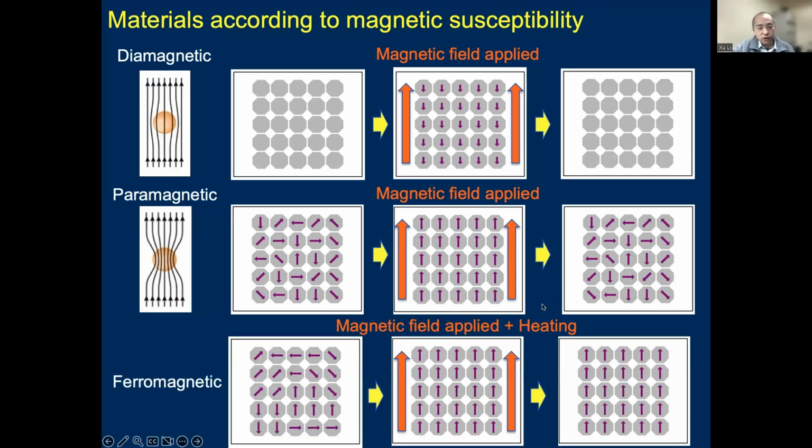And ferromagnetic materials have some small domains, called magnetic domains, which have aligned magnetic moments. And if you put this kind of material in an external magnetic field, all this net magnetization will align with the external magnetic field, creating an enhancement in the local magnetic field.